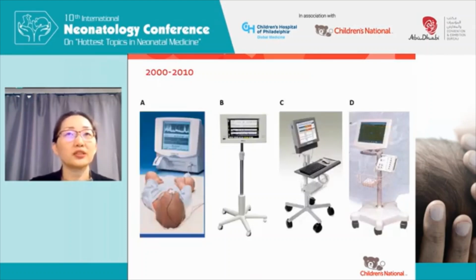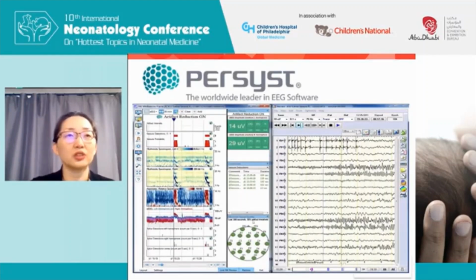And then also recognize that you don't have to be confined to a dedicated aEEG device. Yes, you can buy a device that only does aEEG, but recognize that if you have ready access to an EEG machine, there are software packages that allow you to display trend algorithms in real time in conjunction with the raw EEG tracing, so you don't have to necessarily buy a separate device if you already have EEG machines available.